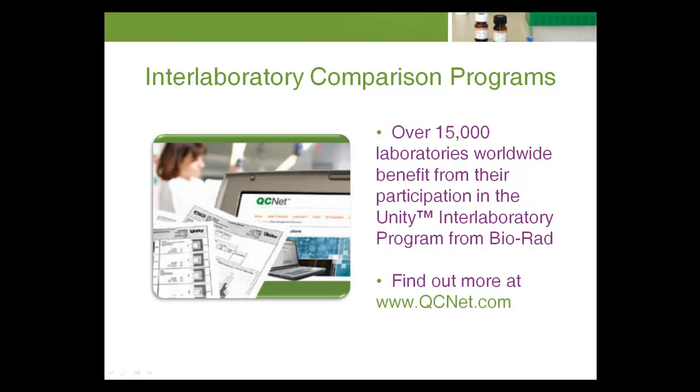Participation in an interlaboratory quality control comparison program is highly recommended. Without such programs, the laboratory becomes a statistical island and has no means to regularly verify the reliability of its work. One of the easiest methods to assess reliability and imprecision is to compare the within-laboratory method means and standard deviations to other laboratories using the same instrument and method.